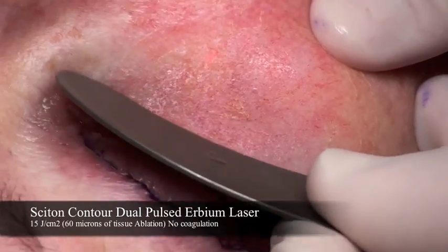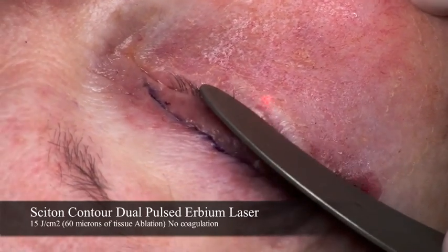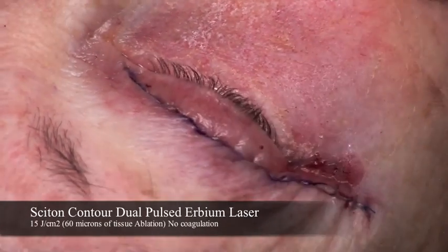Here I'm using a laser-safe backstop to finally remove the epithelium all the way up to the lower eyelid lashes while protecting the surrounding ocular tissues.